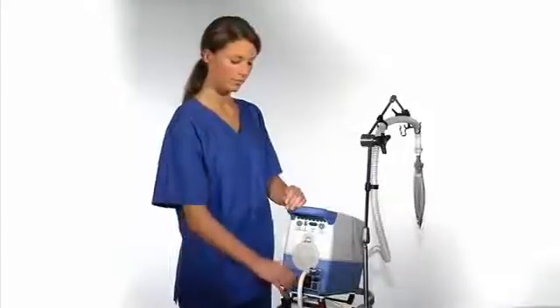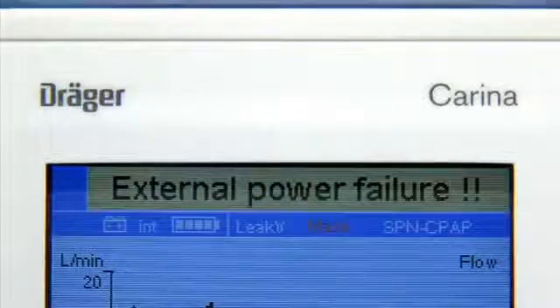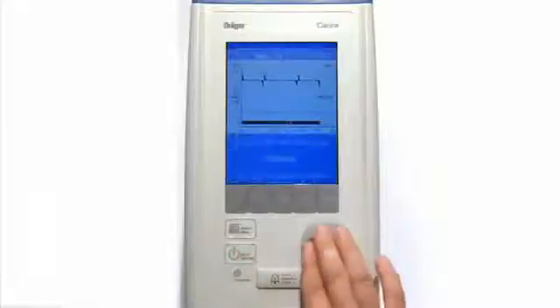Now please disconnect Carina from the external power supply. The alarm external power failure is activated. Next, switch Carina to the standby mode.